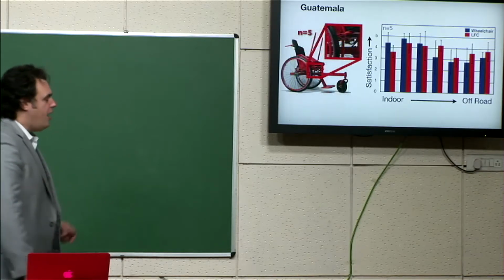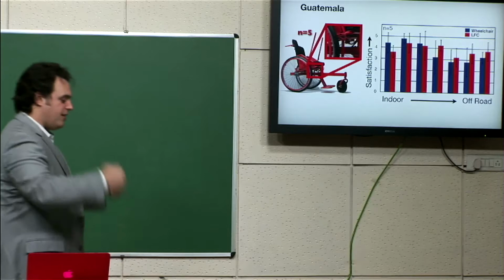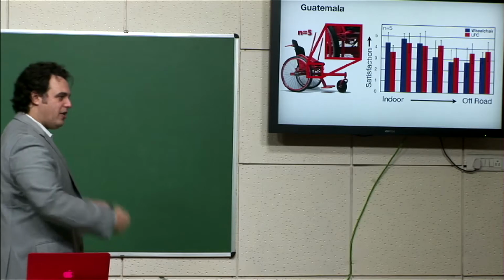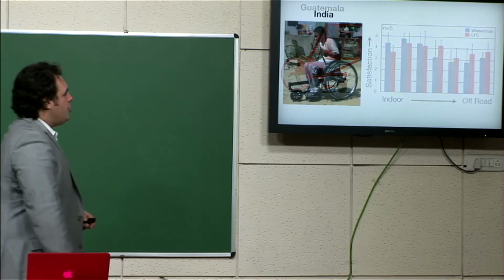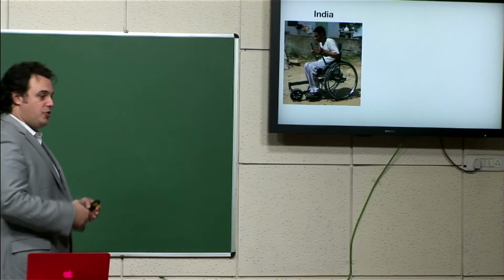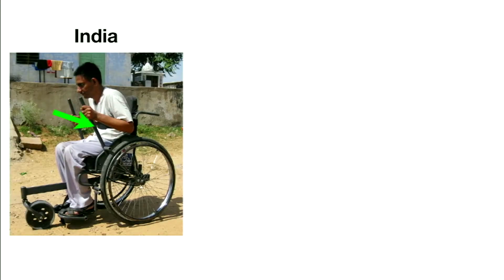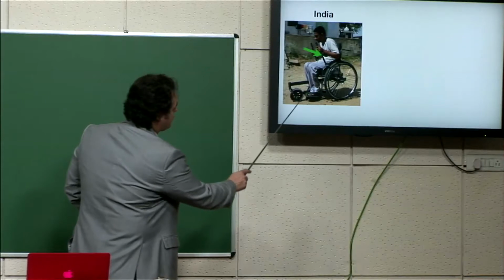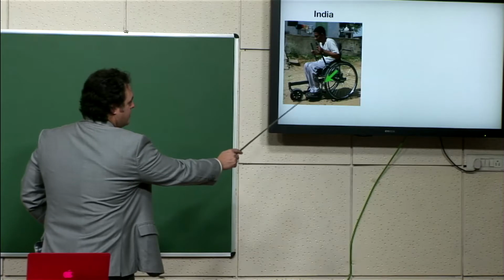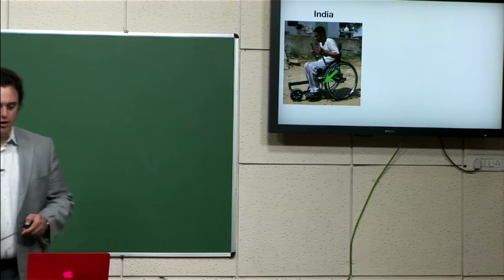They also said the place where we had our parking brake was too high and that when you push really hard on the levers, you could smack the levers into the parking brake. So it was really disturbing when they pushed really hard. So we addressed all these challenges when we did the next design, which we ended up testing here in India. And so in this prototype, you can see he's wearing a chest strap. And actually, he doesn't have them on, but you can see the foot strap right here on the chair. We lowered the parking brake by 4 inches, so it's down here on this little looped structure off the frame, so it's out of the range of the lever push.